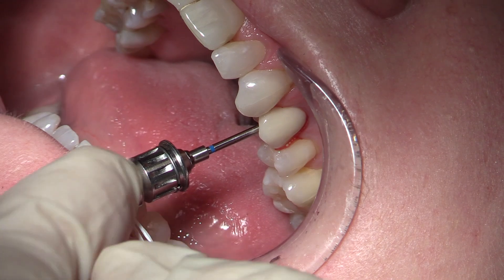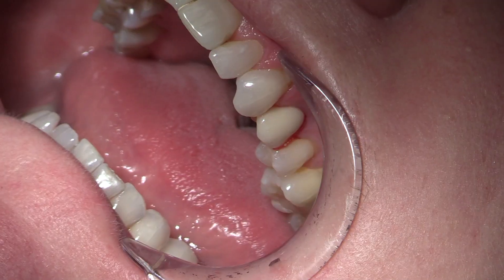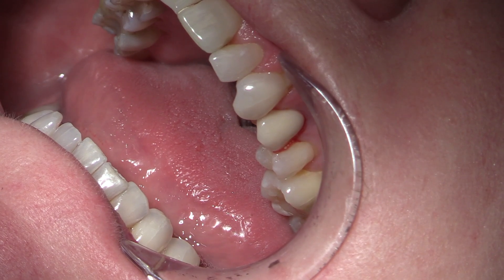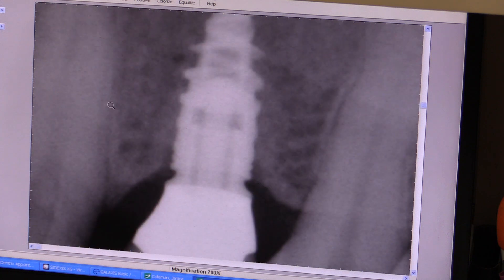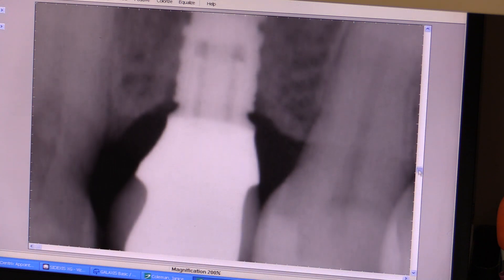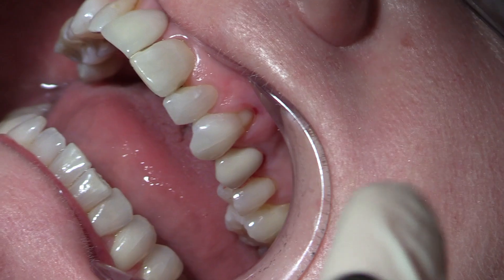Once we tighten this down, the patient won't feel it — it's going to be exactly the same design as the original abutment. I like to take an x-ray of the abutment seating prior to doing the final torque on the implant screw. Here you can see the bone after four years once I'm placing in the ASC abutment — the conical connection is maintaining this particular bone very well. Moving down the abutment, you can see how uniform the porcelain is due to the computer milling of this particular interface.